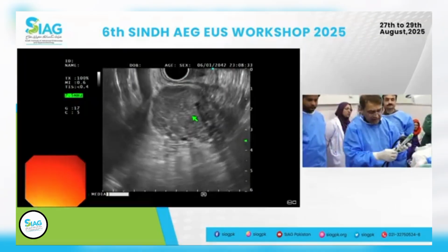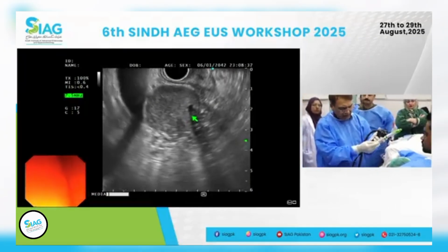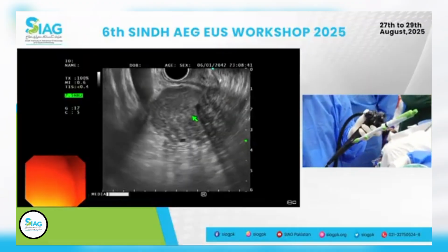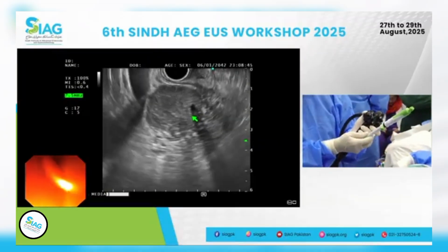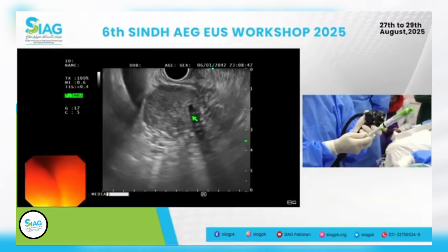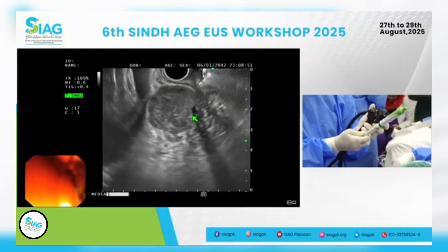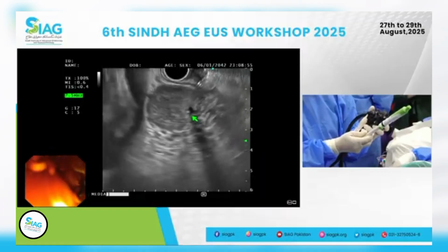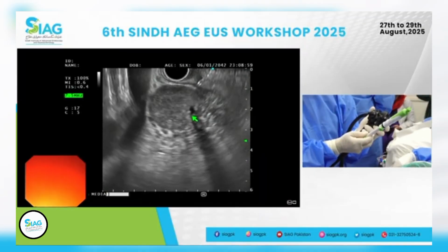The other thing is, in this one, the sheath usually already comes locked at 1 or 2, which is fine. But if the mass is a little bit away from you and you don't see the sheath, I usually unlock the wheel. I want to really get the sheath out of my scope right there. You see the sheath there now? This is not always a one-to-one movement, but right now it's sitting onto the wall, that sheath.